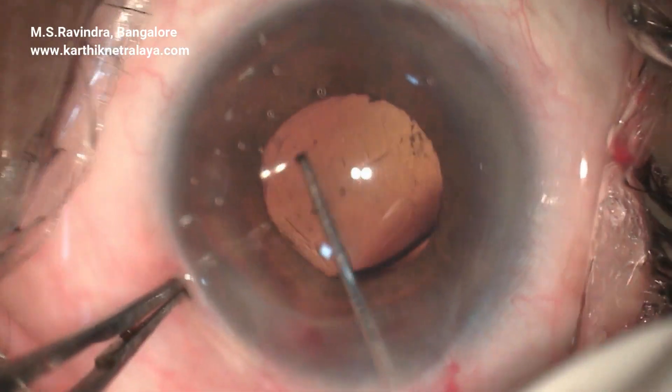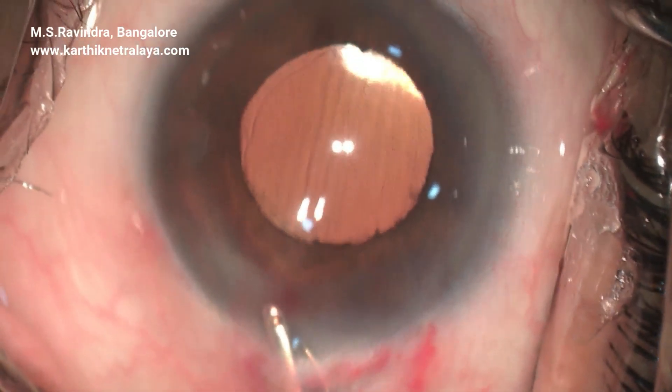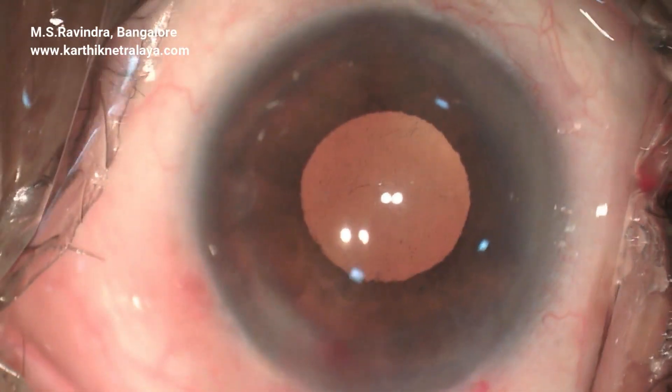Long anterior zonular syndrome is known to be associated with glaucoma, pigment dispersion syndrome, and Krukenberg spindles, but bleeding from the angle region is unusual.